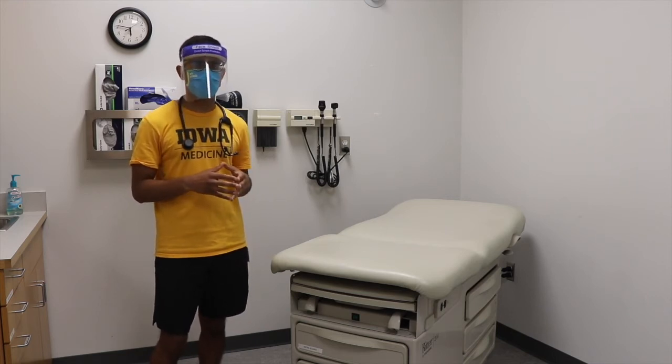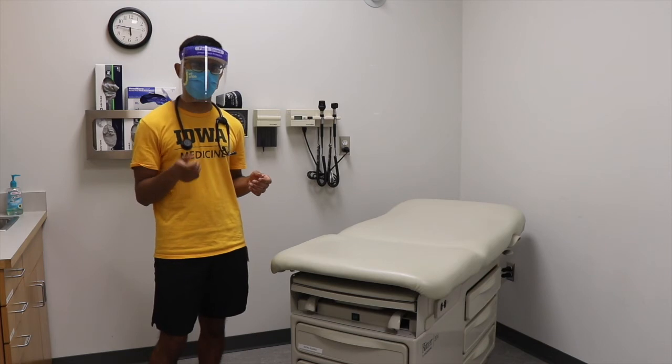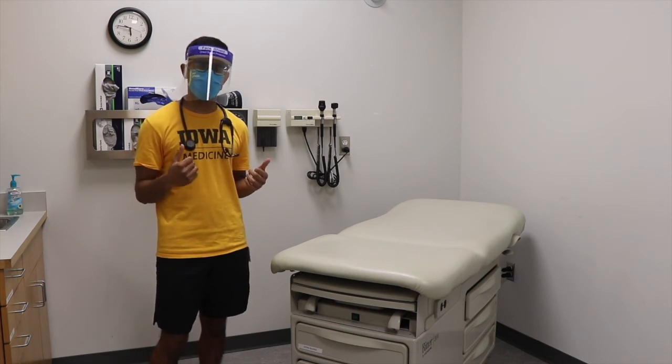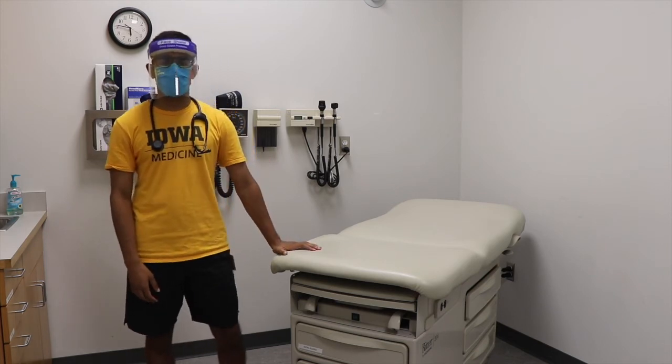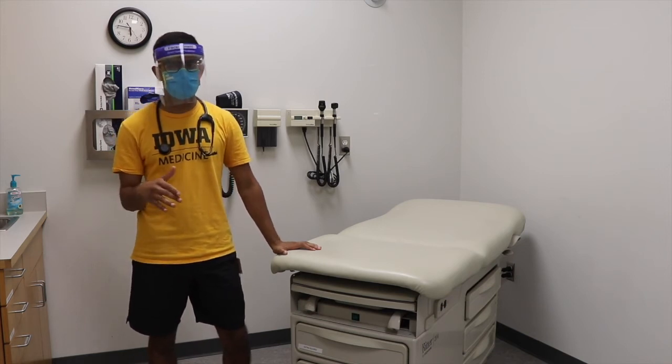Now, we're listening for two things. We're listening for the systolic and diastolic pressure. The systolic pressure is the point at which you first start to hear a sound through your stethoscope, and the diastolic is the pressure at which the sound disappears.